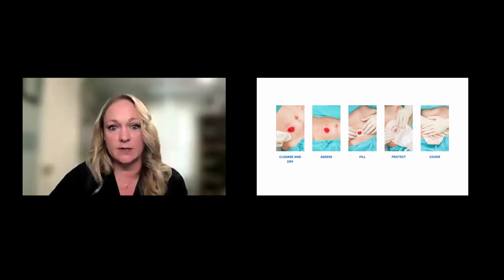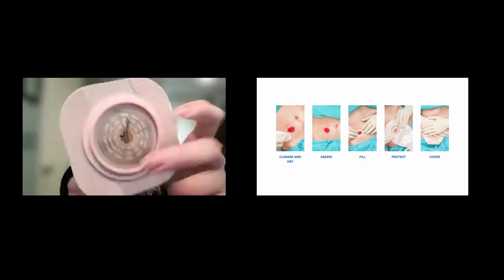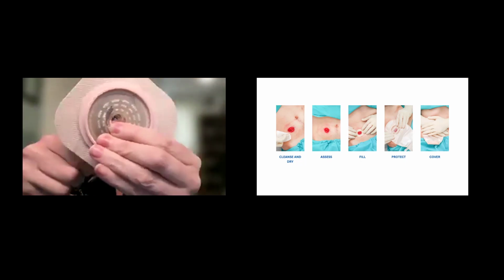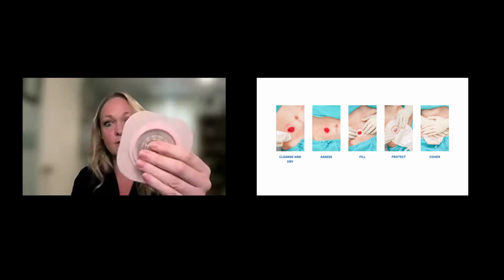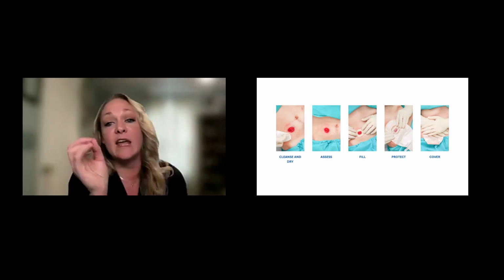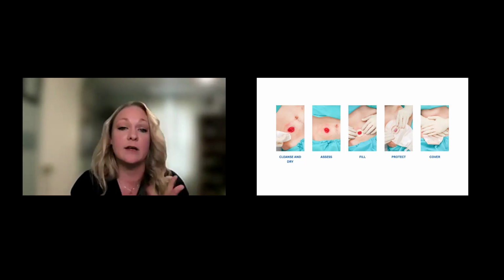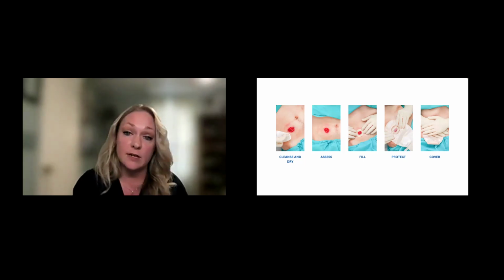And a good trick to make sure we're really protecting the skin around it is to do little cuts all around, up until your line that you need. And that's going to make it easier to cut all the way around. In order to protect the surrounding skin, we don't want to cut a huge hole and place it around the stoma. But we want to make sure to cut it about 1/8 of an inch up until the stoma. So leave 1/8 of an inch because that's going to allow for any swelling and edema or movement. And we're going to make sure that we're not actually cutting or lacerating that stoma.